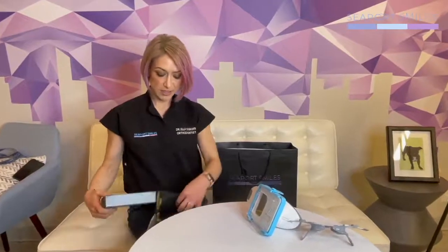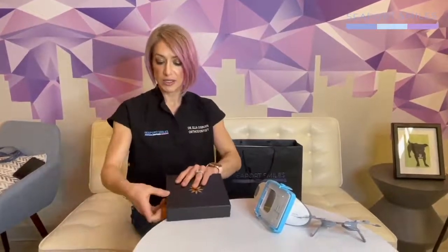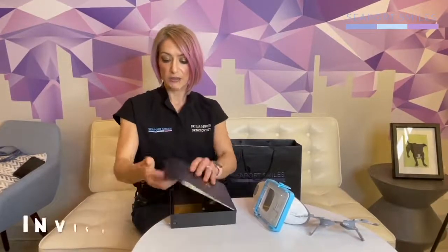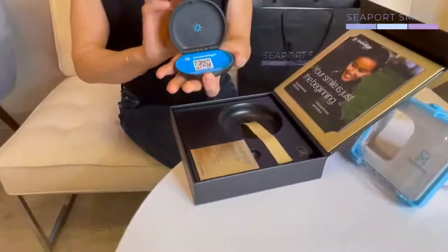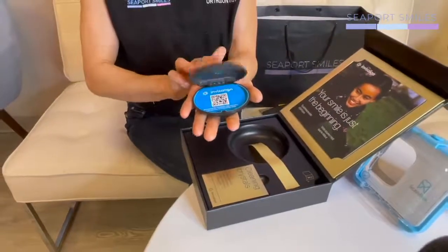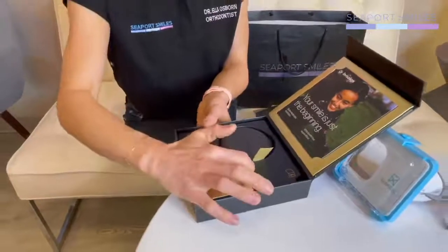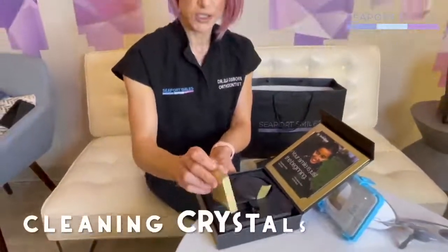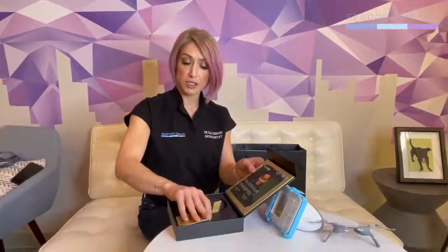The next thing you'll find is a little pouch from Invisalign with a box. In the box is your Invisalign case, which is also magnetic. We always say your liners are in your case or in your face. There will be some cleaning crystals from Invisalign to get you started. You can get more on their website or you can use some of the other methods we talked about, like dental cleaner solution.